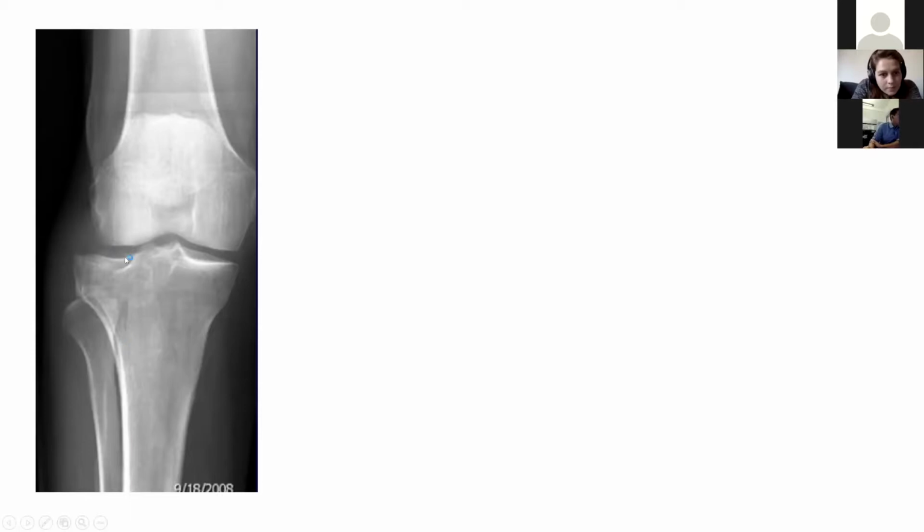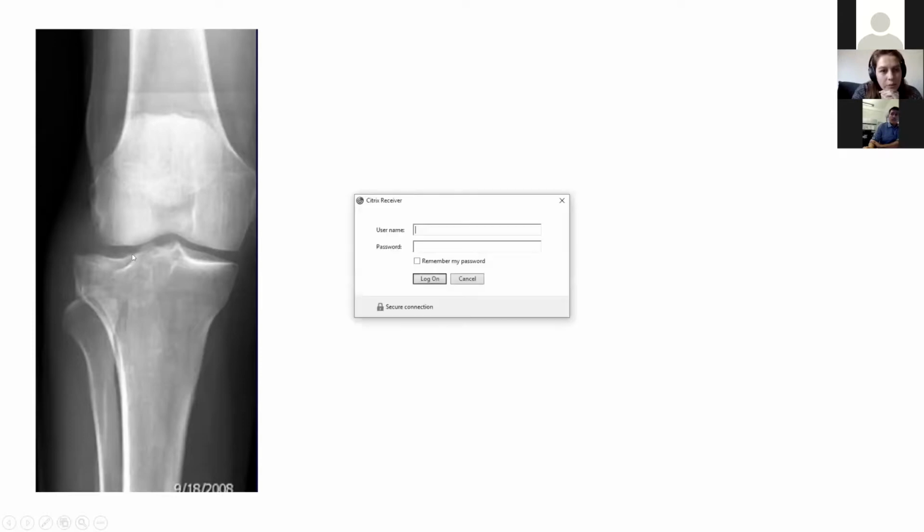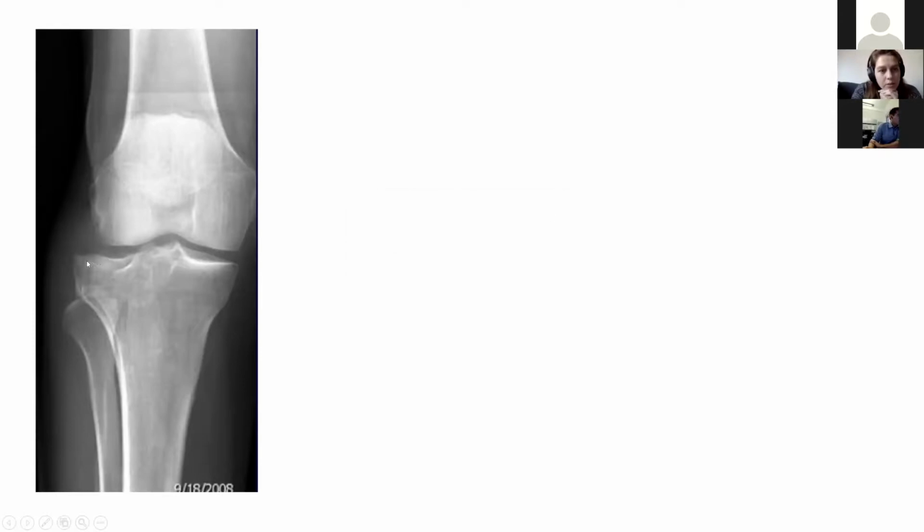Can you see my pointer at all? Yes. Okay, perfect. What's my pointer on right now? That is a contour of the articular surface. I'm trying to figure out if it's anterior or posterior because you see 2, I think. Yeah, you see 2. So there's this one here too. If you had to bet, where do you think this lower one is, this depressed joint surface?